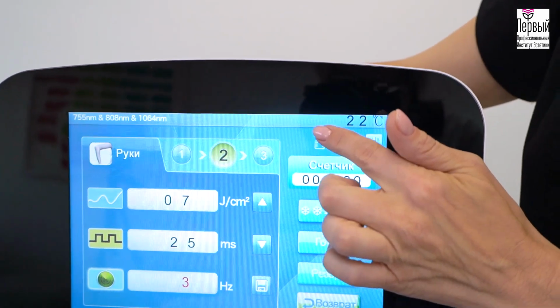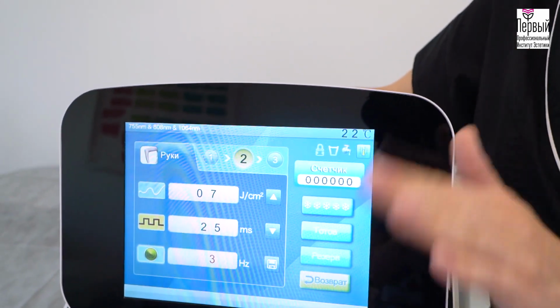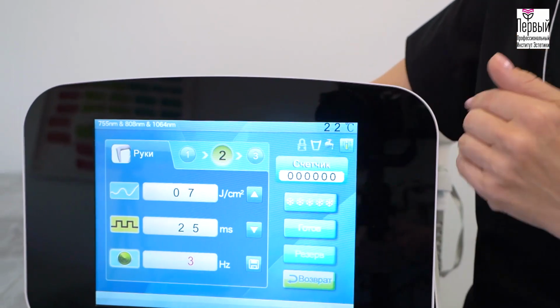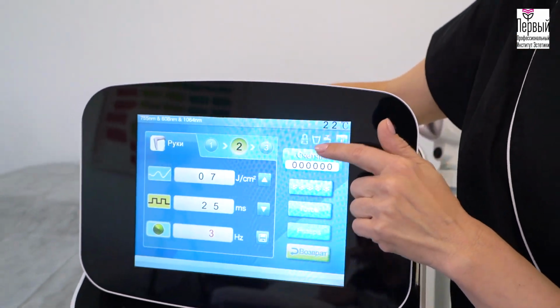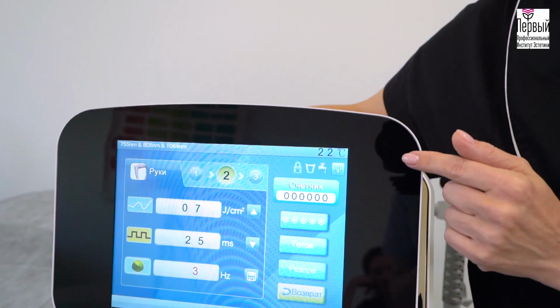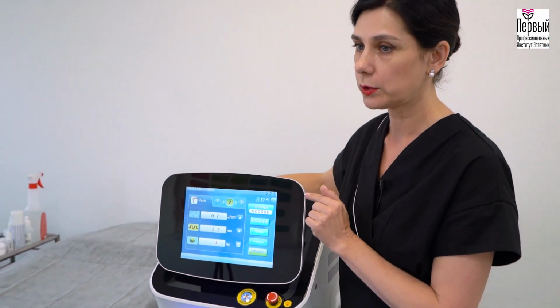The flashing lock indicates that the device will be disabled and we cannot perform the procedure. The basket shows the amount of water in the system. When the basket is full, the amount of water is sufficient. The flashing tab indicates that the amount of water is reduced and must be added. The temperature shows the ambient temperature that is comfortable for device operation.